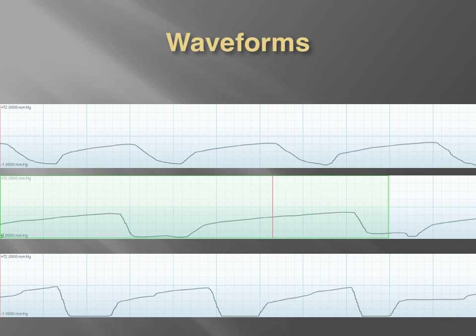Nevertheless, if we look at the waveforms for all of these, okay, they all have a consistent theme. That being, the waveform is not necessarily upright, but following more of that shark fin pattern. Now, this is what we would see on a printout versus what's on a screen. What's on the monitor screen is condensed. So this is a little bit more representative of what we may be seeing, and we cannot be mistaken that any of these strips are a normal waveform.